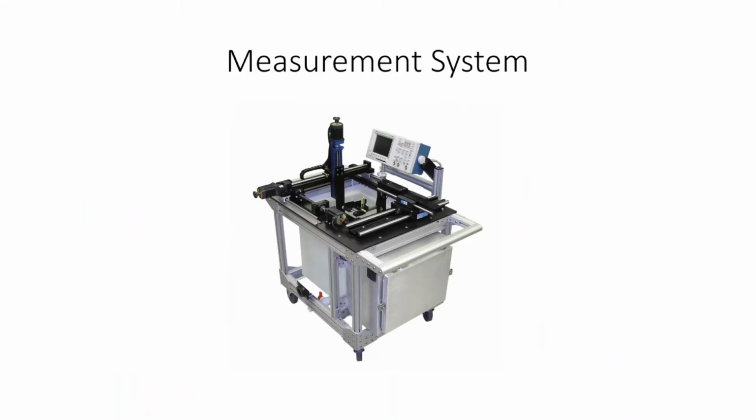This is a picture of a typical imaging measurement system designed to make hydrophone measurements.